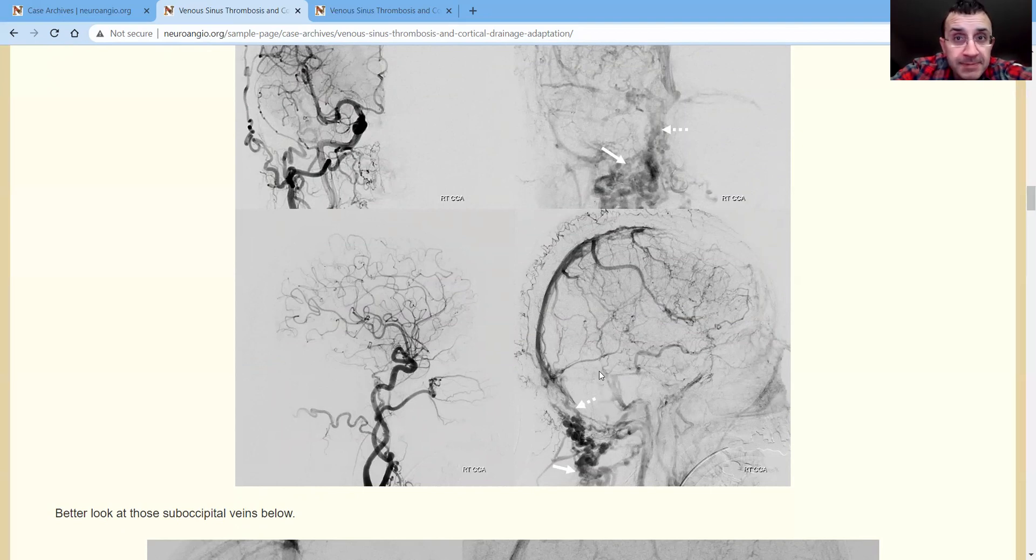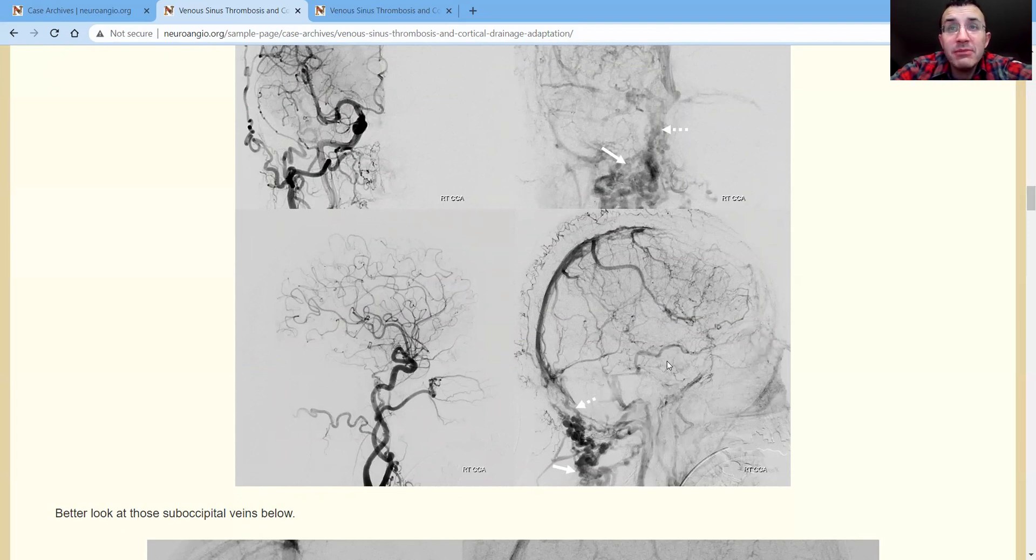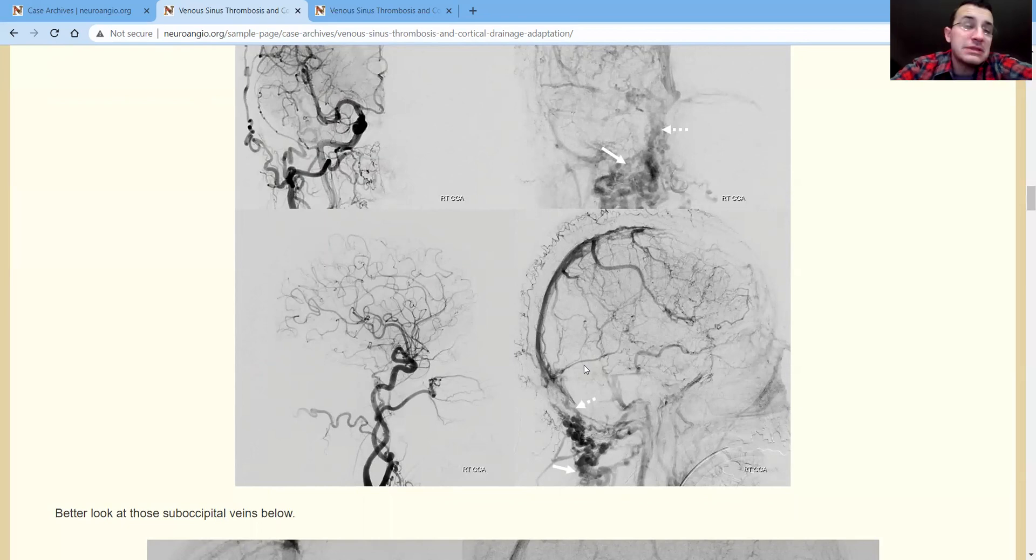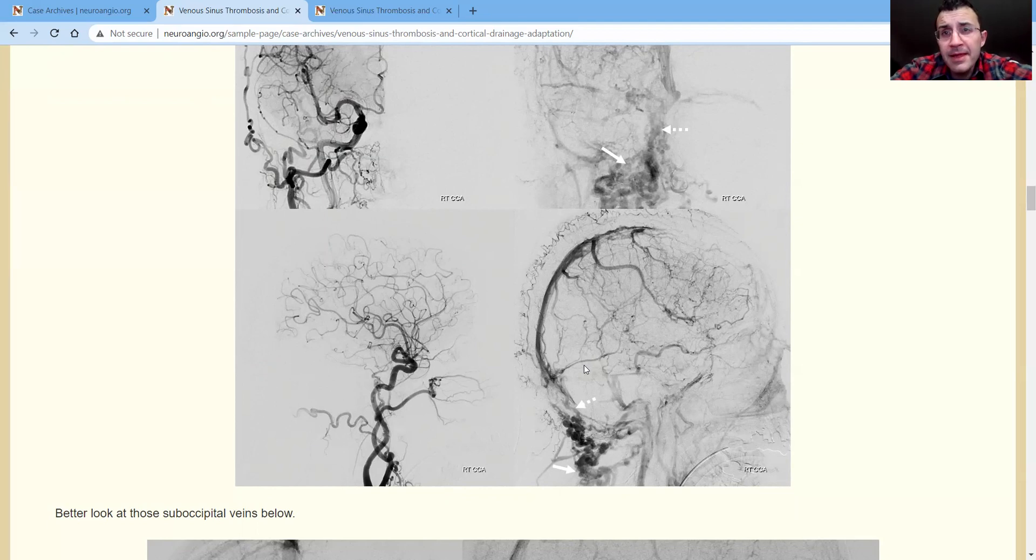The superior petrosal sinus is draining into that open segment of the sigmoid sinus. Remember that on the MRI? This was open. That's coming out into the jugular. So now you've put stuff together for the right hemisphere. You understand there's a lot of clot despite all of that. She's okay. Why? Because of this alternative outflow. Now you understand all of this and just say, yeah, whatever, she's fine. But sometimes that's true.